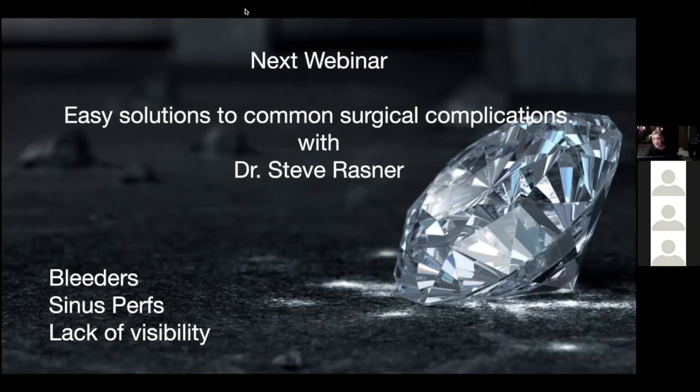I would have to tell you somewhere between 40 minutes or more, I would be done. What you don't want to do is torture this patient with breaking off root tips because you're stuck for 2 hours because you're embarrassed. It is okay. Some teeth are hard to get out. I had a hard time with one just last week. Had roots longer than Godzilla. It was really tough. And it is okay to pack it up.